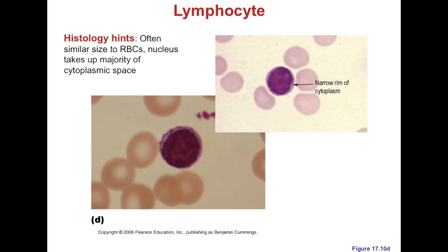All right, so lymphocytes. We just went through the first three, the neutrophil, eosinophil, and basophil. Those were all the granulocytes. Now we have two more left, and these are agranulocytes. Lymphocytes are also really common. About 20 to 50% of all leukocytes are lymphocytes, so you'll find these a lot too. They're quite small. They kind of look like basophils, but they don't have granules in them. And they do have visible cytoplasm that shows up as this blue crescent.